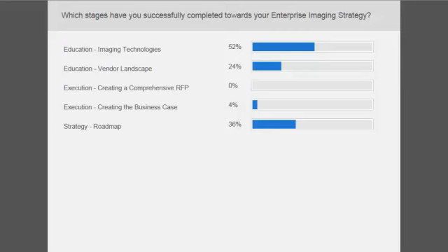And of course your business case. Depending on your organization, this can vary. Some organizations, this is a top-down project, so your business case has somewhat already been bought into. Others, it's a ground-up process, as it was with us, and it's something that you have to build your business case and your leverage points and sell all the way up through your organization. So this one, I've seen it go higher, I've seen it go lower.